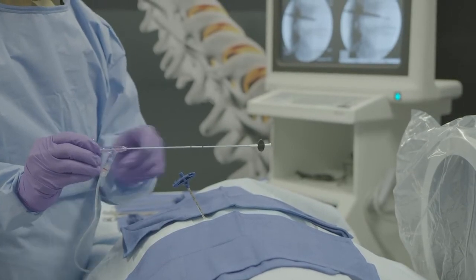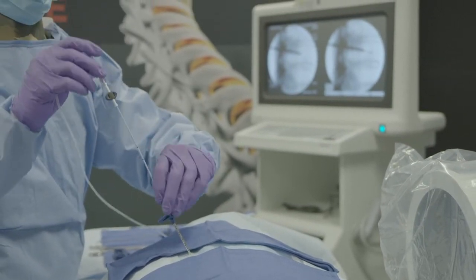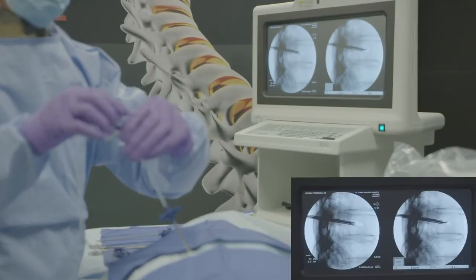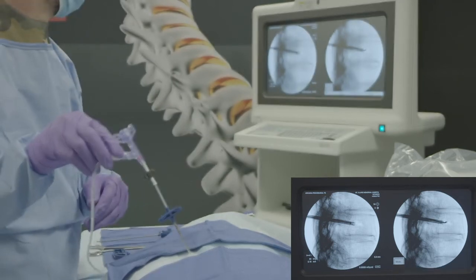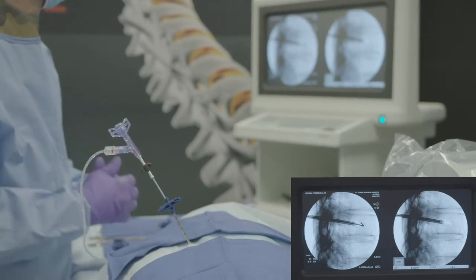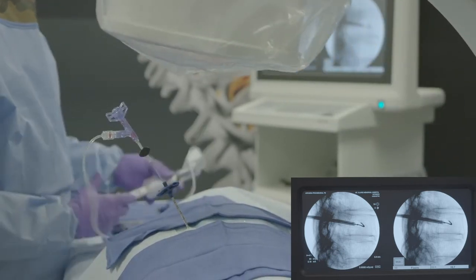The Arcadia balloon is equipped with a resheathing tool that can be locked into the hub. Do not remove. In the lateral view, insert the Arcadia Steerable balloon into the access cannula until flush with the distal tip. Begin turning the steering handle on the Arcadia Steerable Balloon Catheter clockwise to aid in directing the distal portion of the device when the distal radiopaque marker of the balloon has exited the working cannula.